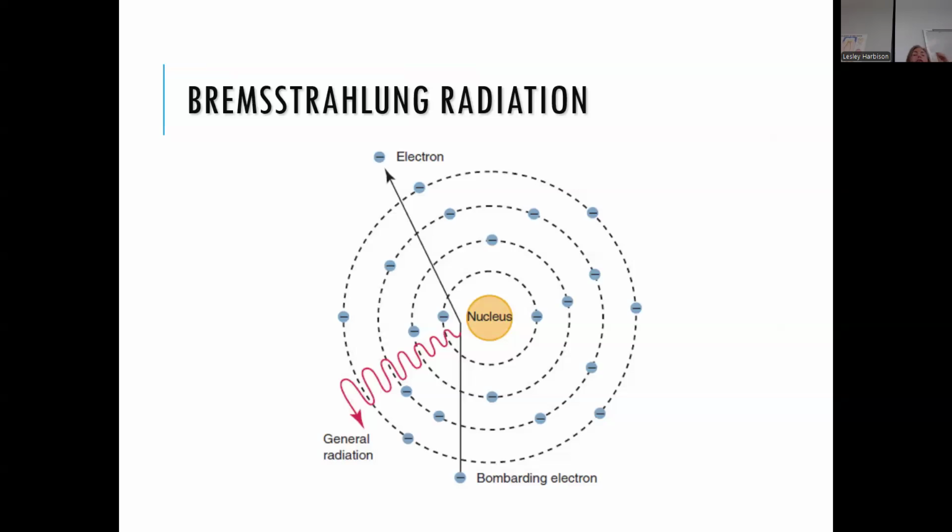on a microscopic level, when we're looking at the atoms of the tungsten, that bombarding electron is going to come into that atom, and there's all of those valences, those orbiting electrons. It flies in and doesn't actually come in contact with any other electron in a valence. It just makes its way through somehow and gets really close to the nucleus.